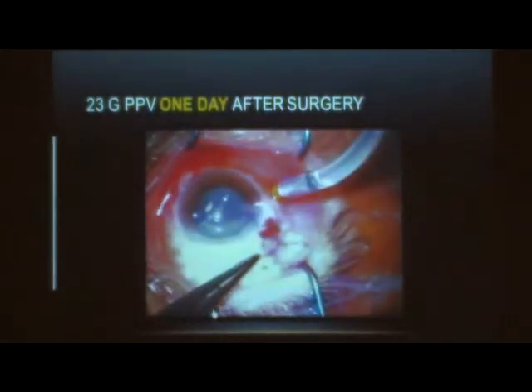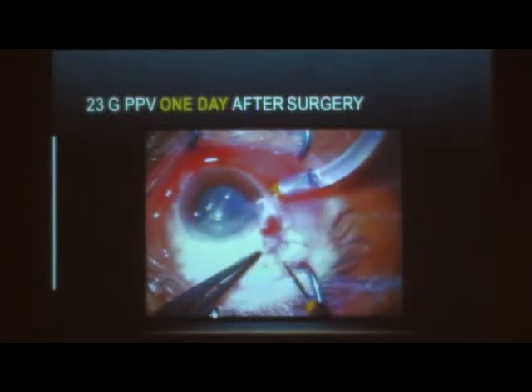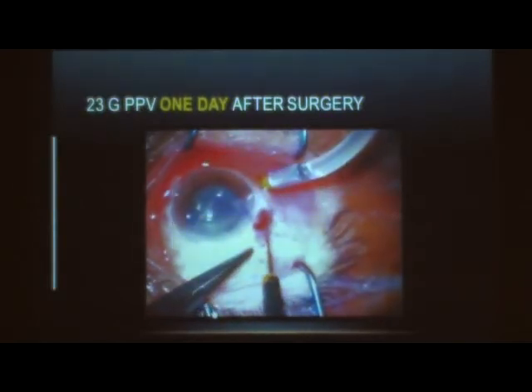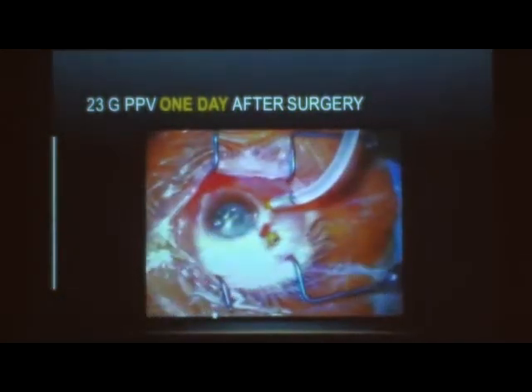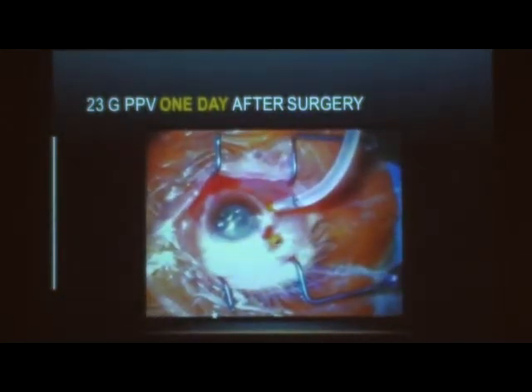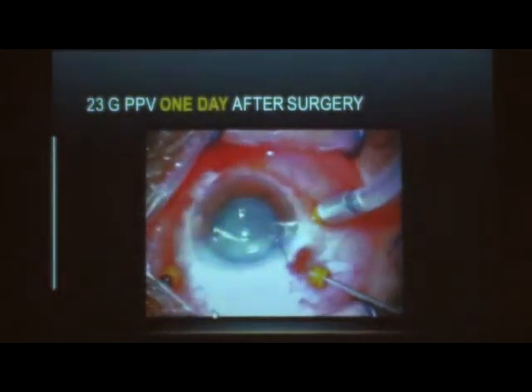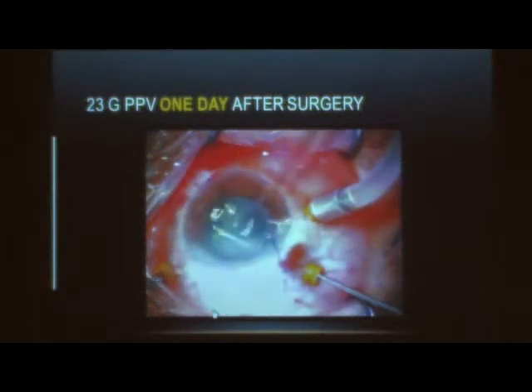And then you put your other 2 sclerotomies. Again, this surgery might seem easy, but I think it requires experience, an experienced vitreous surgeon, because you don't want any retinal breaks, you don't want suprachoroidal infusions, you don't want retinal detachment. So you actually want to have a clean, nice attached retina with a healthy macula.